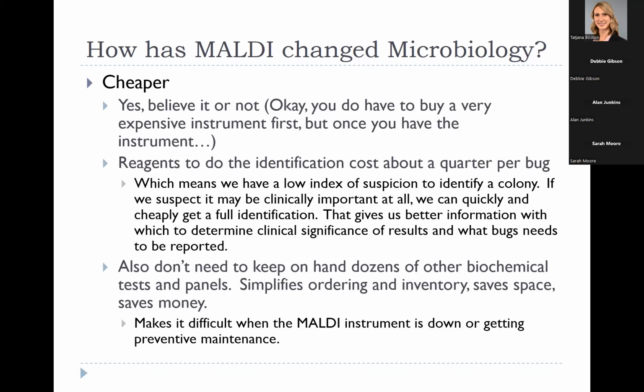What about now that we have MALDI when we call it Pseudoglutamicibacter cumminsii? Is that still considered a common skin flora organism? And is it still going to be considered a contaminant and therefore not a CLABSI? Made it a lot trickier to do that kind of thing.